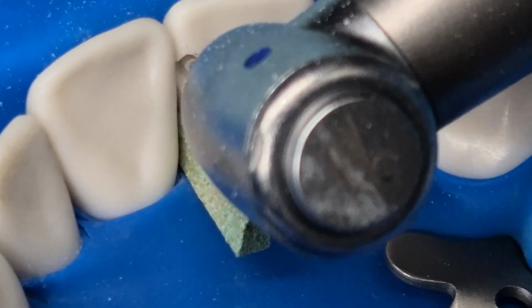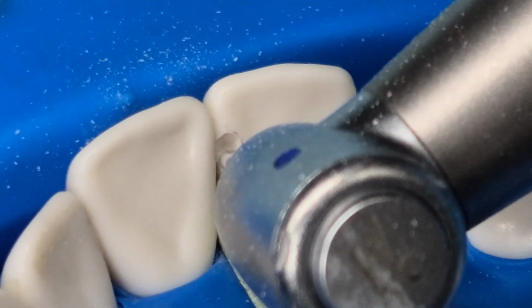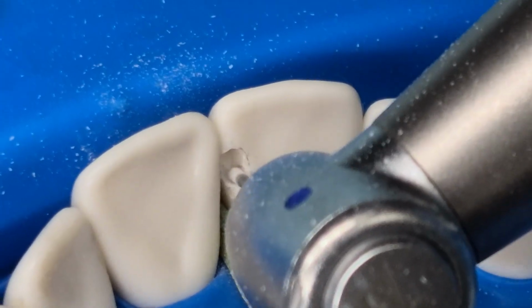Here I'm trying to define the internal line angles. I'm barely touching the floor as the depth has been established already. So I'm just applying slight minor pressure on the walls as I'm moving the burr throughout the prep.